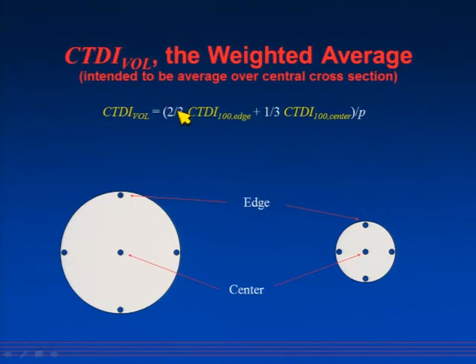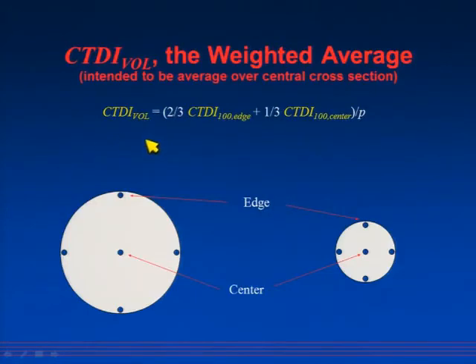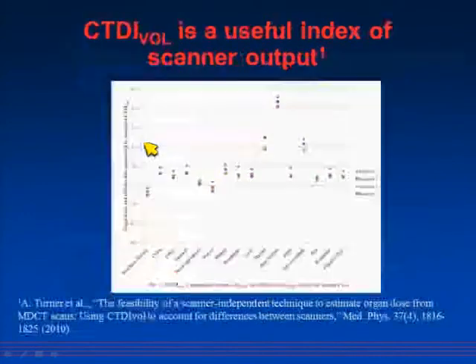Now, those of us who've been doing ACR accreditation for a while will notice that pages and pages were published on what we really mean by NT, because that was a source of real confusion. But when you calculate CTDIvol, it doesn't matter. You could put in any number you want. You could put in negative square root of pi. You can go to your dose tables and your Excel sheets that you get from the ACR and put any number you want in for N or T, and CTDIvol won't change because it's in the numerator and in the denominator of the ultimate equation. A lot of other numbers were changed, but not that. So CTDIvol is not dependent upon NT at all. It's factored out of the equation.